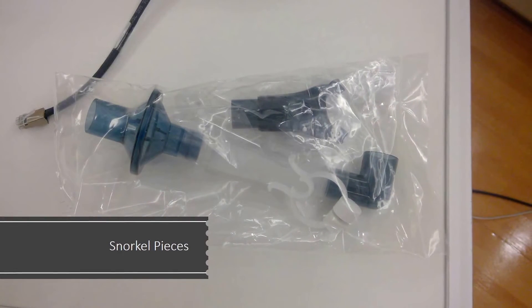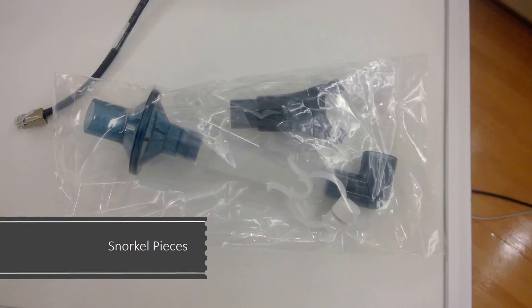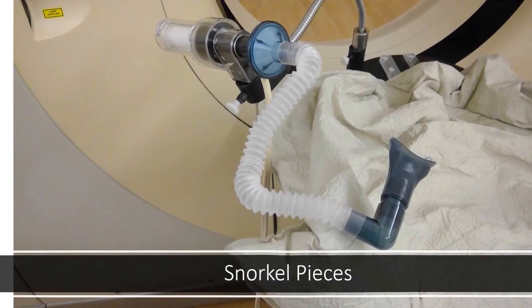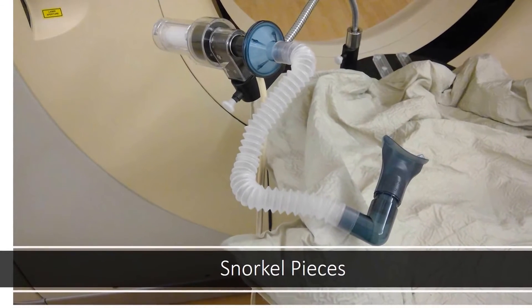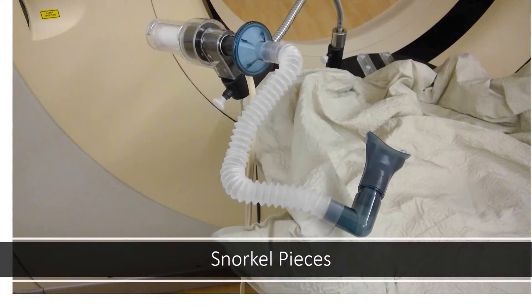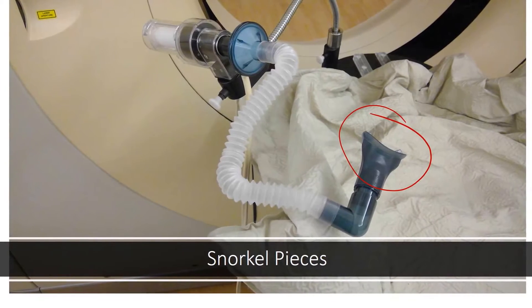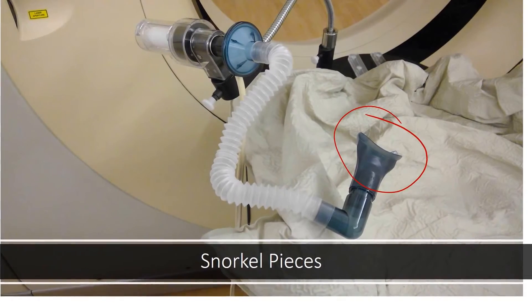This bag consists of the mouth pieces and the nose plugs or the snorkel that you'll use. These will be thrown away and you'll be given a brand new set each day for treatment. This photo depicts what the snorkel pieces look like when it's all put together and hooked up. Your mouth will go around this part here and the tube can be manipulated so that it is as comfortable for you as possible.